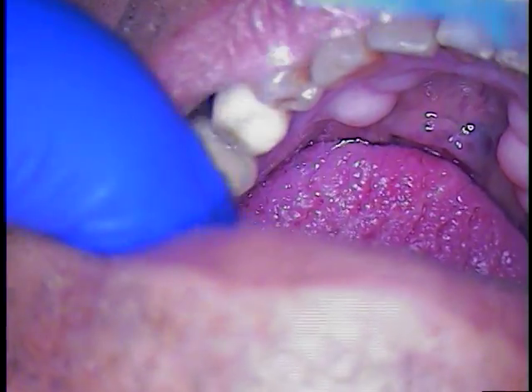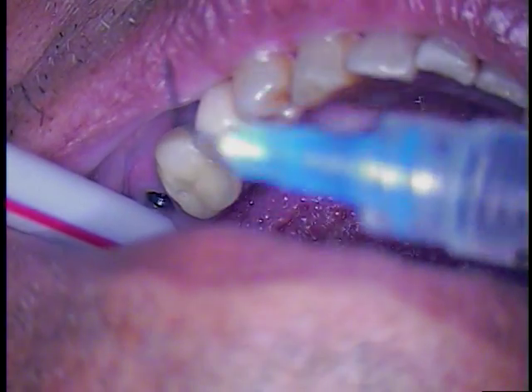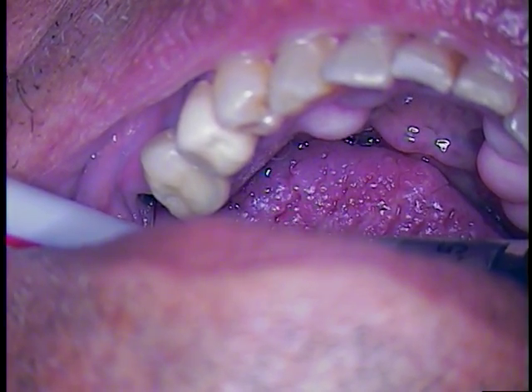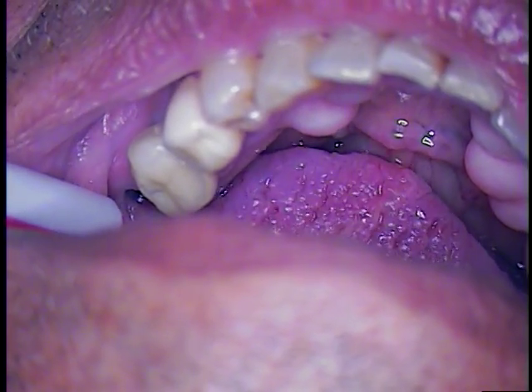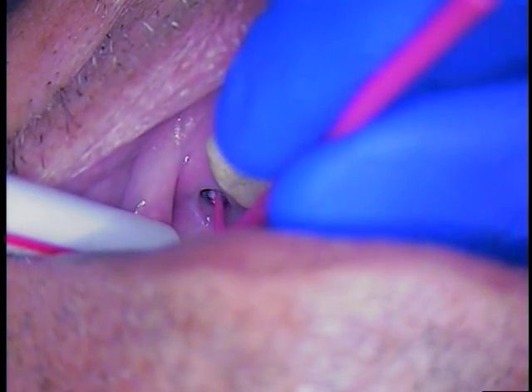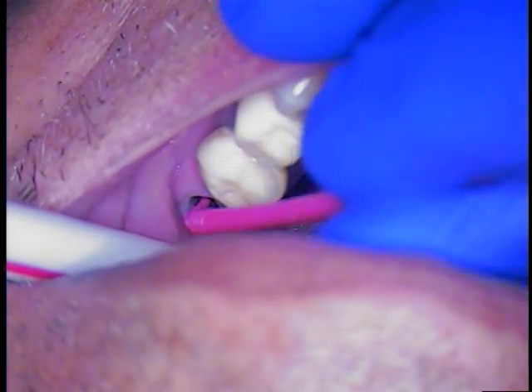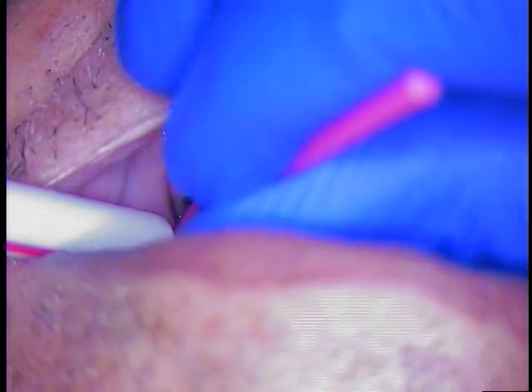It does break up calculus or mineralized plaque, so we have to assume there's probably been some form of deposit in the thread. Clean the threads thoroughly. Then we take a new brush and go in again, rotating as I take it up and down — up and down, rotate, and turn.